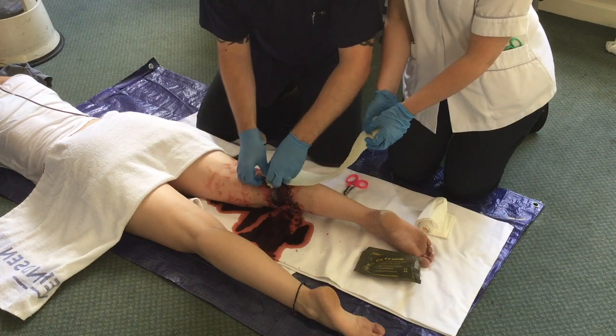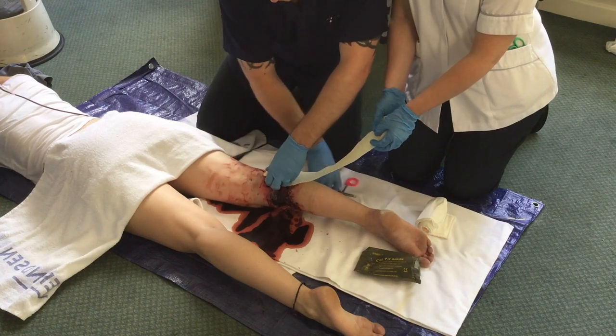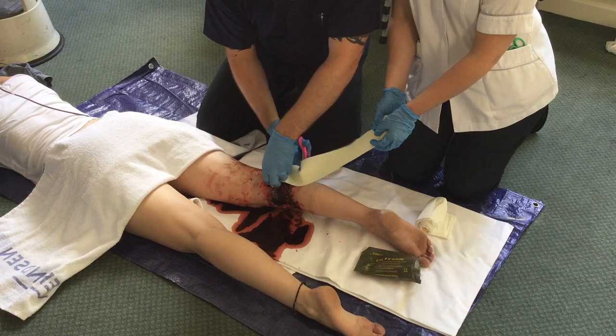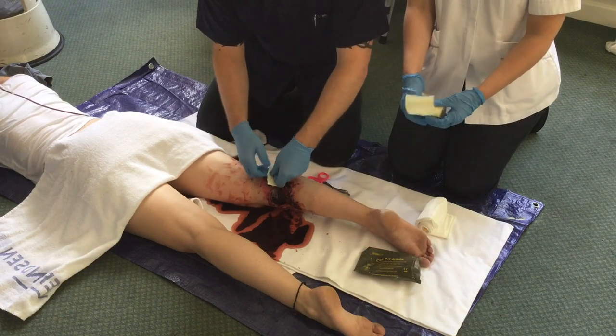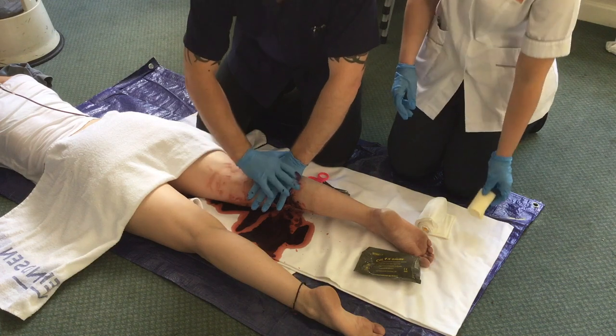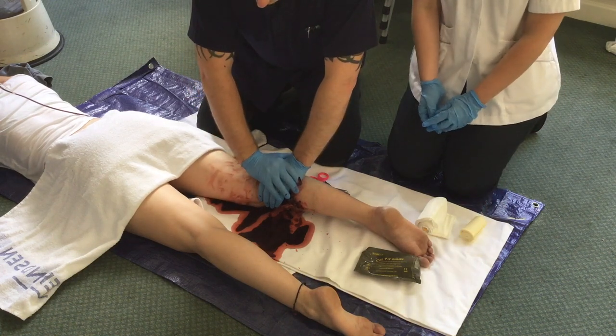When the operator is happy that the wound is full, the Seelox gauze may be cut in order to reduce the length of gauze in the wound. Pressure is then applied firmly for five minutes.